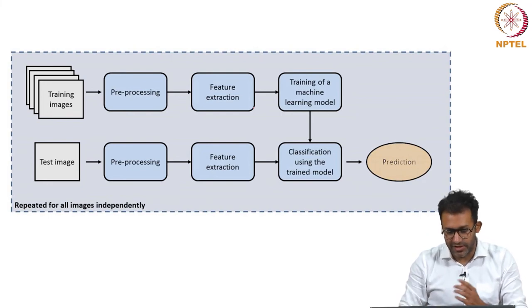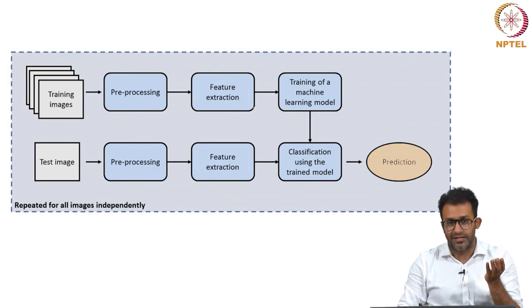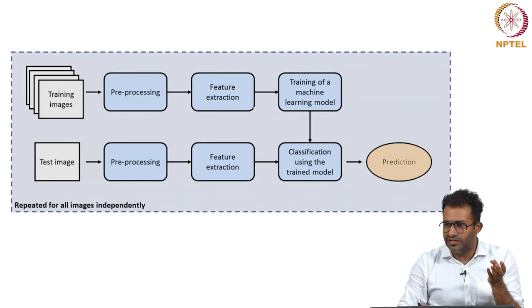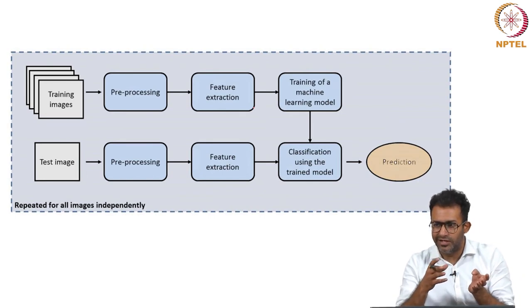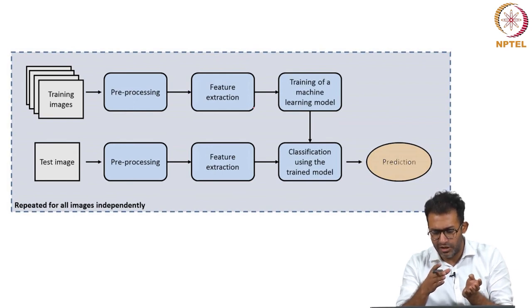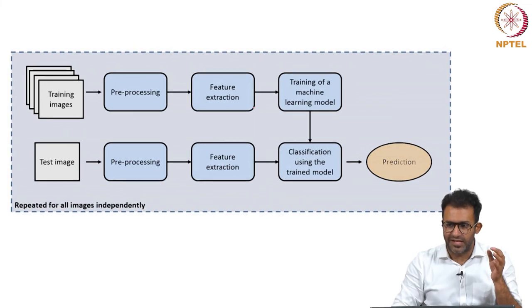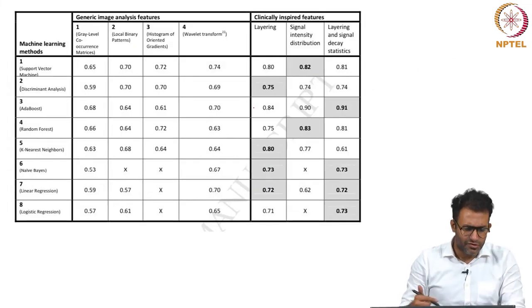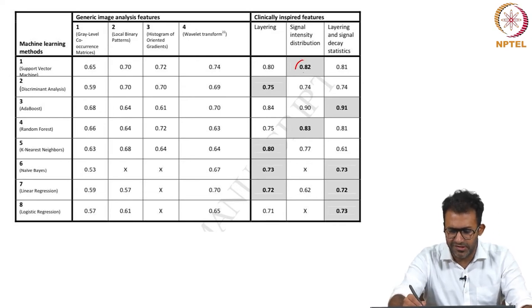There was classification again, and using all these models, they were able to predict the presence of cancers. That accuracy is compared to the gold standard, which is a surgeon measuring the images or extracting those features, as well as the actual gold standard, the biopsy specimens, where you are able to confirm whether there is actual cancer or not. So, these were the machine learning models used. The most successful models are highlighted in gray.